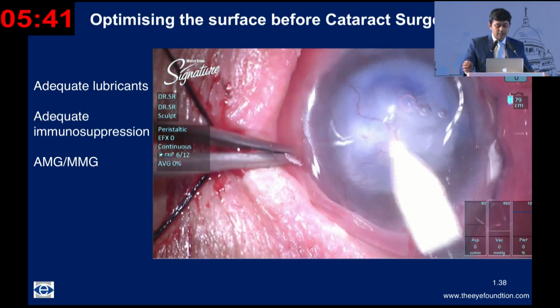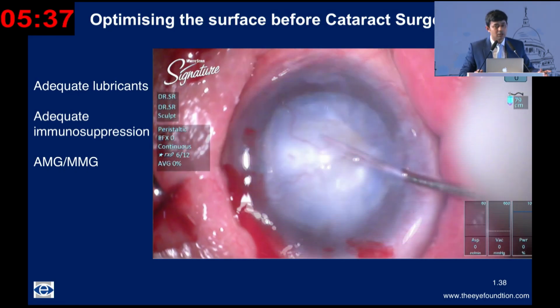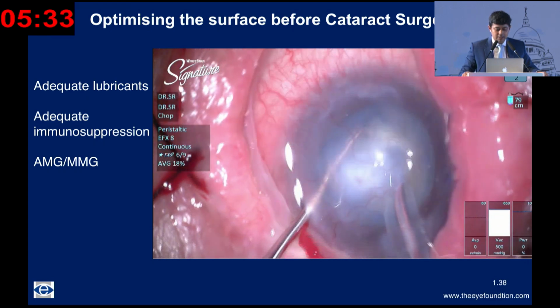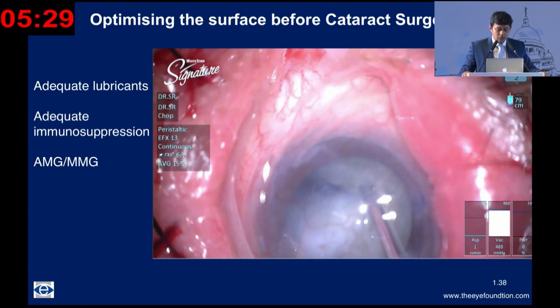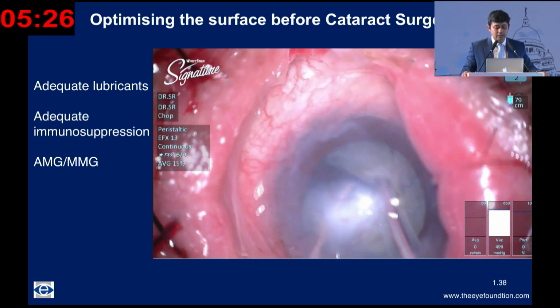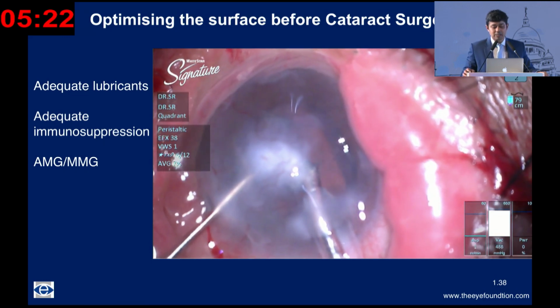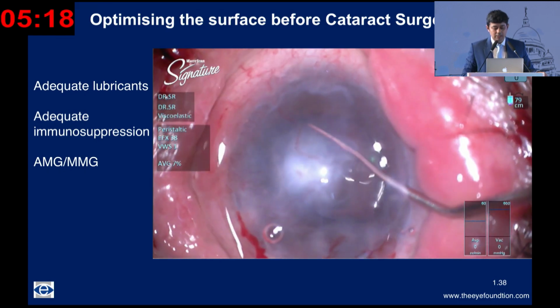For the cataract surgery, some minor modifications may be necessary because the fornices may not be formed. You may have to use sutures to retract the eyelids, traction sutures, and then when doing the chopping maneuvers, do it away from the area of opacity, tilt the globe downwards. The rhexis is also to be initiated away from the site of opacity and to be finished. I will show it in subsequent videos also, and then use a 3-piece IOL.